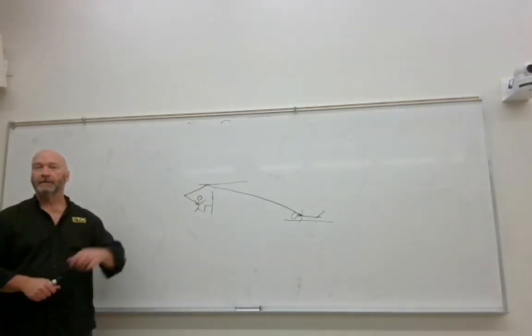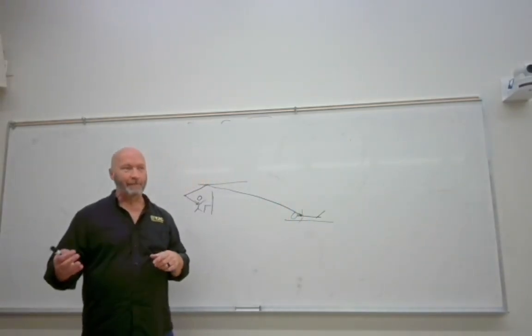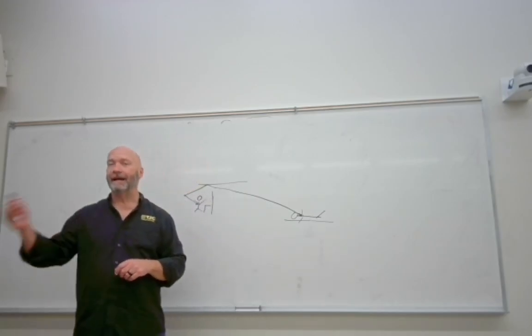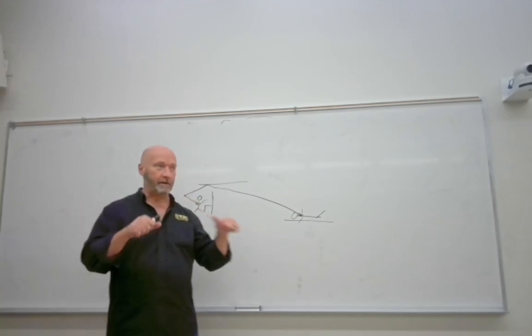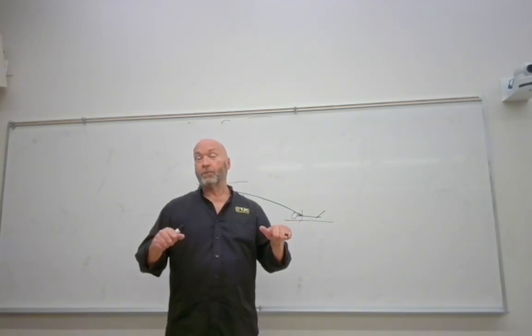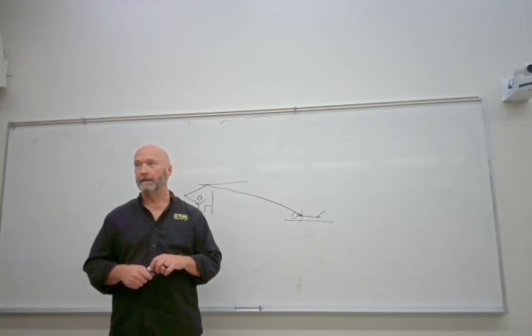You're doing portables. I think I mentioned this before. You're driving a battery powered portable. You can tell battery powered portables because they're motor driven. If yours doesn't have a motor that you have to engage to move it, it's not motor driven. Get out of the room. But if you're with a machine that, whenever you get onto the elevator, kind of protests a little bit, there's a reason for that, and it's because it's full of batteries. Batteries have a lot of fluid in them, but they also have a lot of lead.